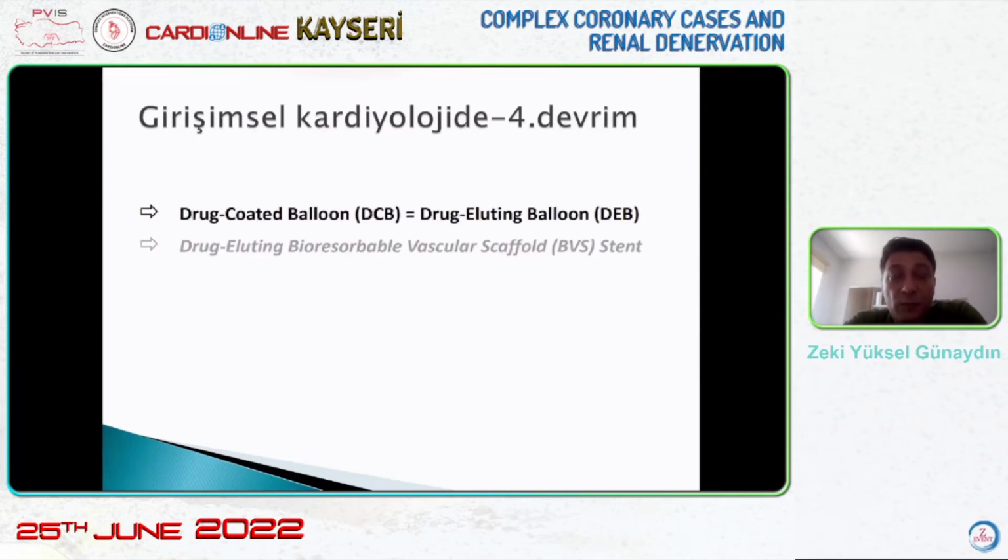And then a fourth development, drug-coated balloons, and there are the bioresorbable vascular scaffold stents. And of course, these did not give the right results.